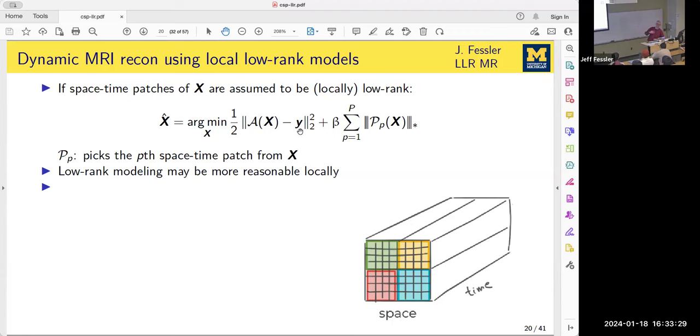The dominant source of noise is, in case you guys are curious, we have these receive coils next to the body. In the body are all our spins, our hydrogen atoms fluctuating around, and they are a source of thermal noise that the coils pick up. And you've got central limit theorem on steroids there, a very large number of spins producing a signal in the coil. But you're talking about something different, after some data processing. This is the raw data, no processing over here.